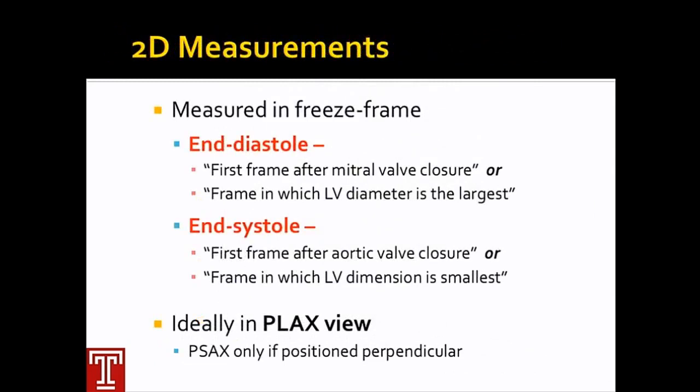2D measurements, again, are the preferred way to go. They should be measured in freeze frame. This too leads to a little bit of controversy. Even if you read Dr. Lang's excellent guideline document from 2015, and perhaps he'll share with you his preferred method, I know I've looked through it carefully, because Dr. Susan Wiggers, former president of the ASE, who's been a mentor of mine but now is a colleague, and I argue about this continually, about when to measure things.